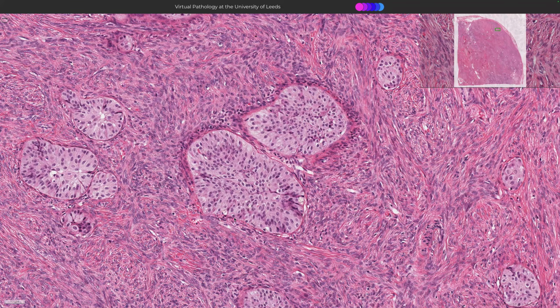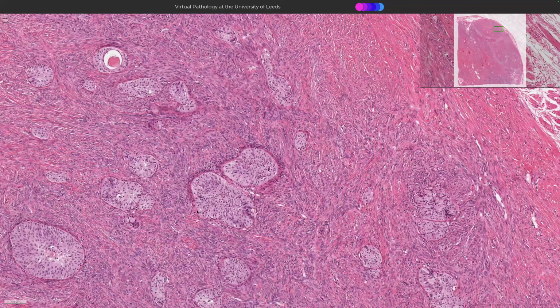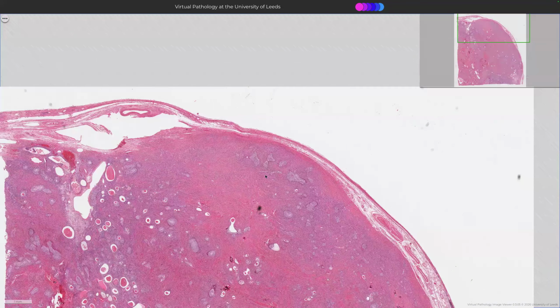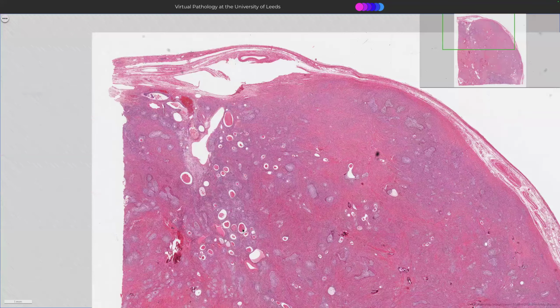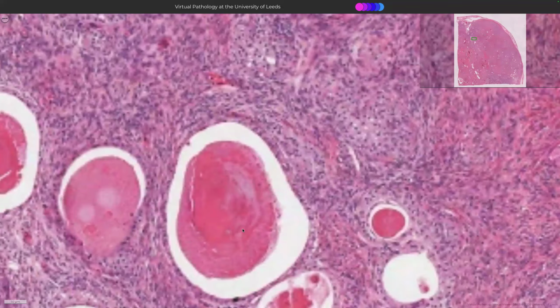Do they have a nuclear groove like transitional epithelium? The answer is sometimes. Maybe I'll be able to convince you that one's got a nuclear groove. And then what happens next to these Brenner tumors? Well, some of them start to develop into cysts. Still a Brenner tumor, still waiting for the tiling to resolve.